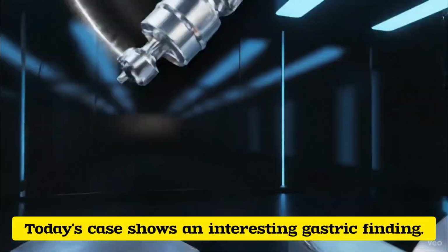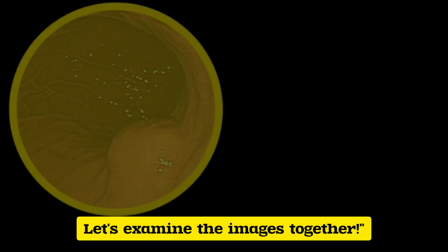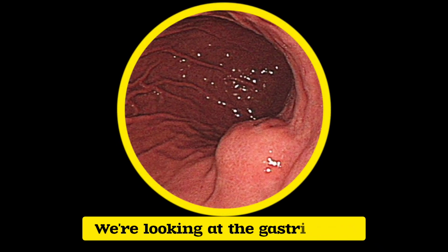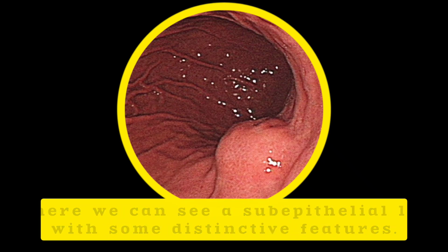Today's case shows an interesting gastric finding. Can you identify it before the reveal? Let's examine the images together. Let's start with our endoscopic view. We're looking at the gastric body, and here we can see a subepithelial lesion with some distinctive features.